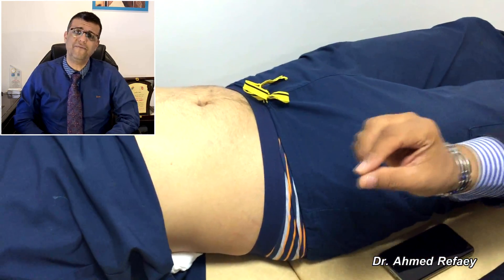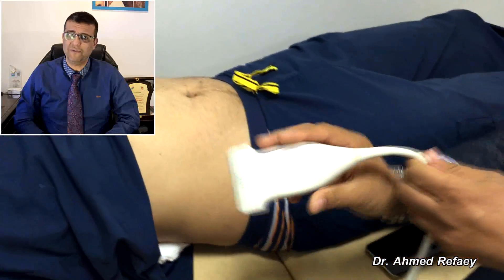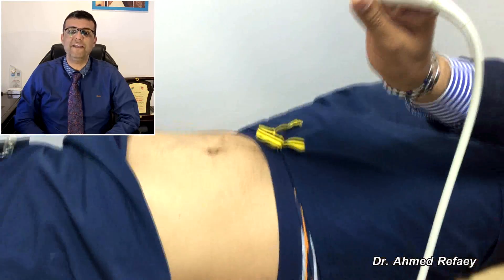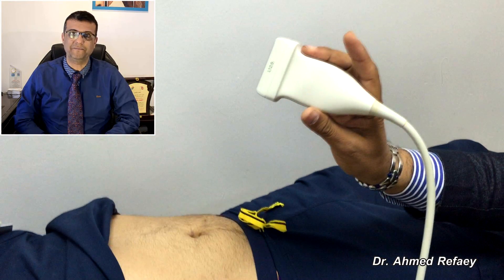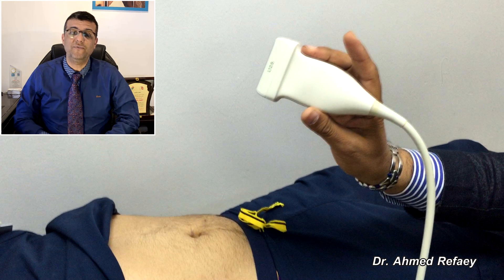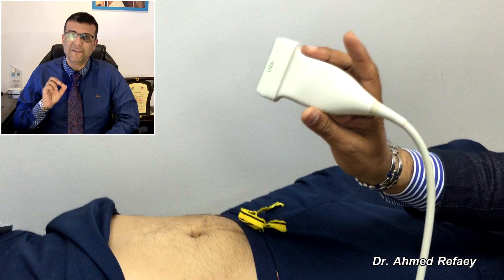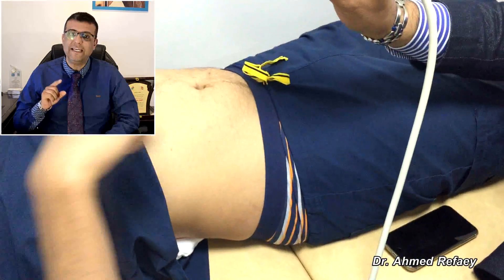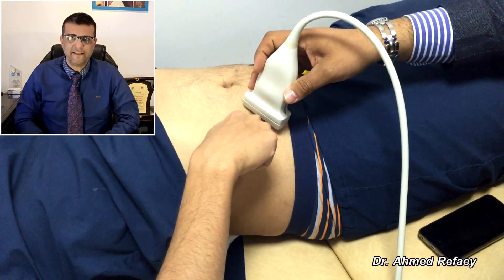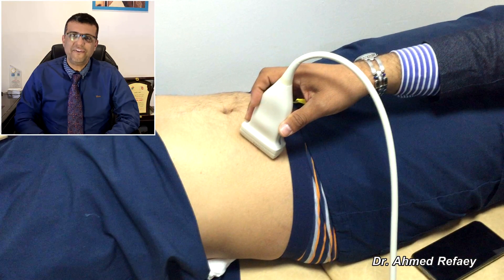Number one: use a high frequency linear probe transducer from 7 to 12 MHz. It has limited penetration but very high image quality. Number two: ask the patient to localize the maximum site of pain. Usually in cases of acute appendicitis the pain is localized and the patient can point to the site of pain by the tip of their finger. After that, put the probe at the side of their finger.